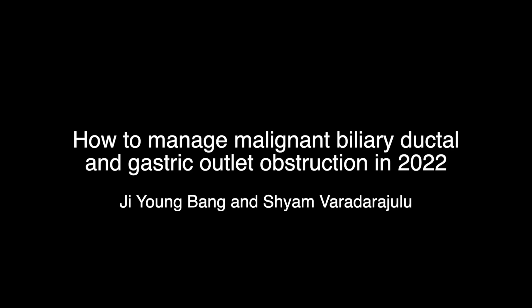In this video, we will be demonstrating how to manage malignant biliary ductal and gastric outlet obstruction in 2022.